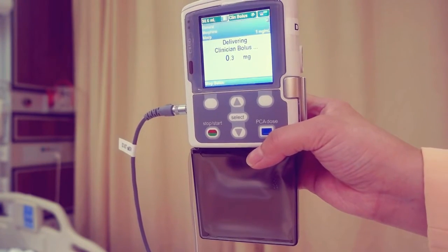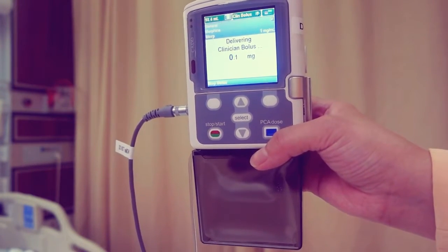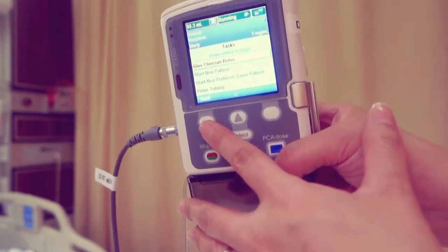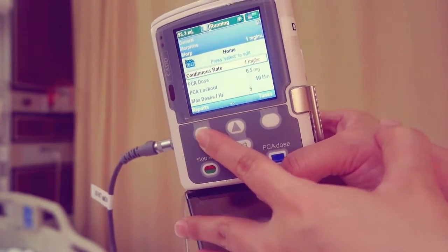After the desired value is delivered, clinician bolus complete displays. Press ok. Never leave the pump unattended while on the clinician bolus edit screen. You must press back to go to the home screen.